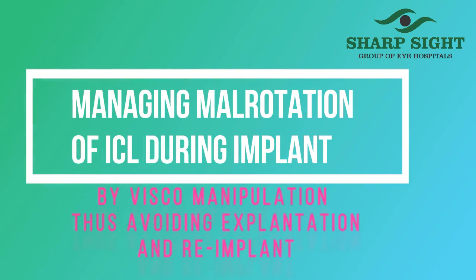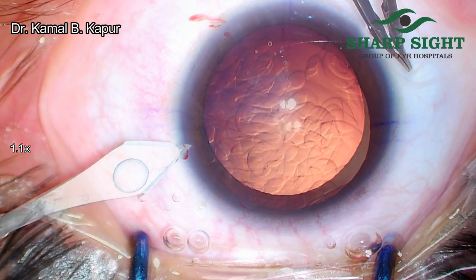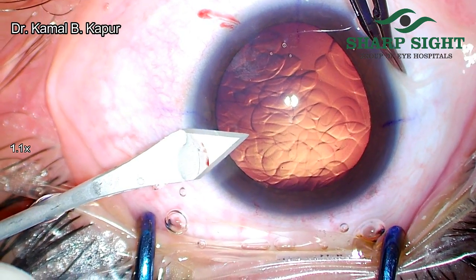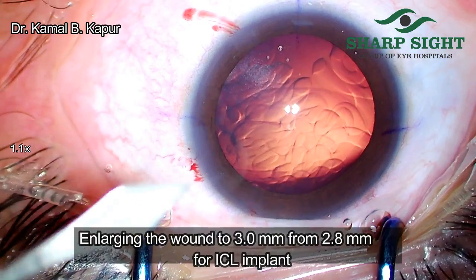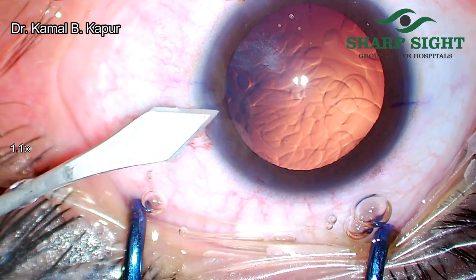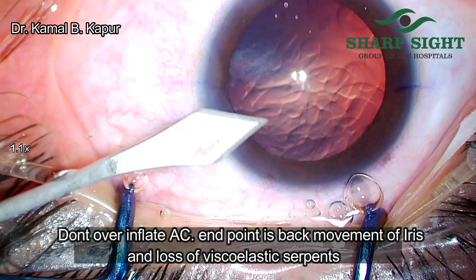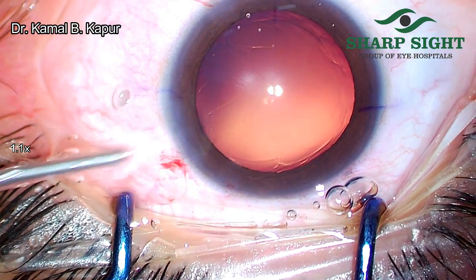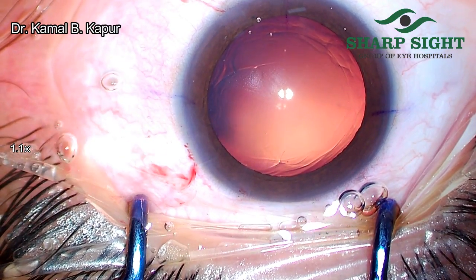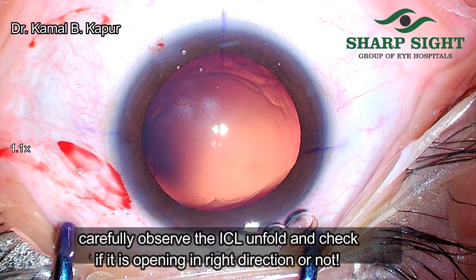In this video, we will learn how to manage a wrong or faulty opening of an ICL while you've injected more than 2/3 of it. We start by making an incision after the globe has been made taut with viscoelastic. For ICL, we would like to enlarge this wound to 3 mm, because that's the best recommended size for the ICL. Once that is done, viscoelastic is injected, making sure that we don't over-inject.